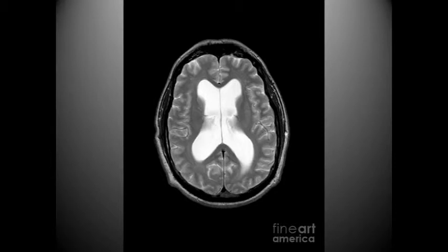Okay, here is an example of hydrocephalus as well. Notice the lateral ventricles being very, very wide. That is the primary characteristic of hydrocephalus. You're going to see the ventricles being very, very wide, usually the lateral ventricle being extremely wide, because located in the occipital horn of the lateral ventricle around here is the choroid plexus producing cerebrospinal fluid.